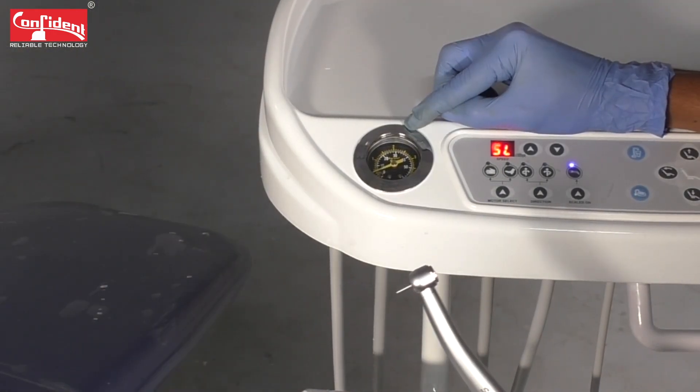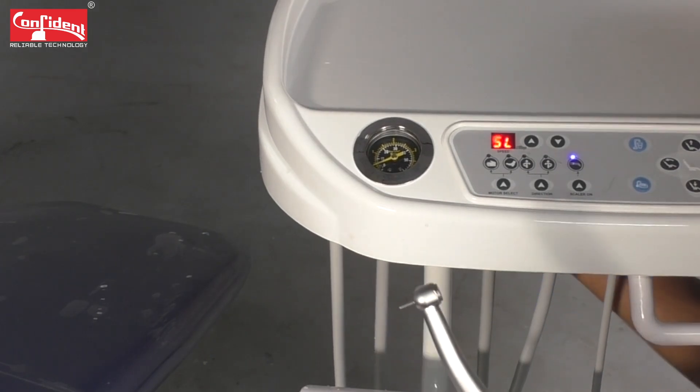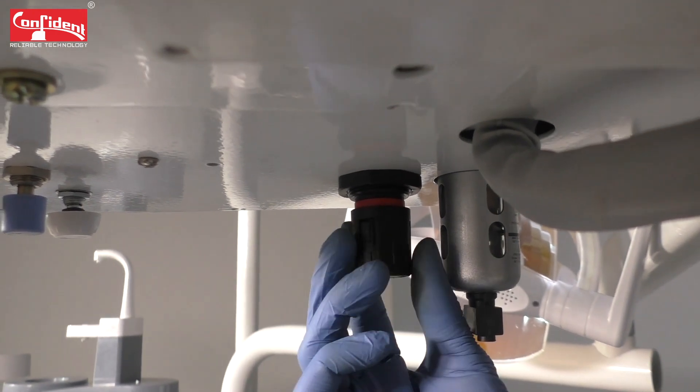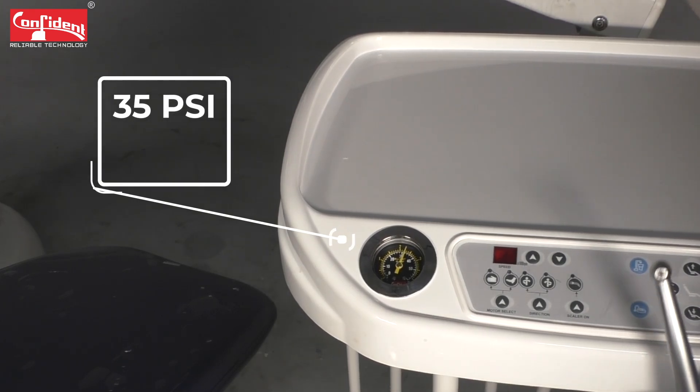In order to increase the air pressure going into the air rotor, you need to rotate the controller located at the bottom side of the trolley. Make sure that you rotate the controller clockwise to increase the air pressure, and keep rotating until the pressure gauge reading increases to 35 psi.